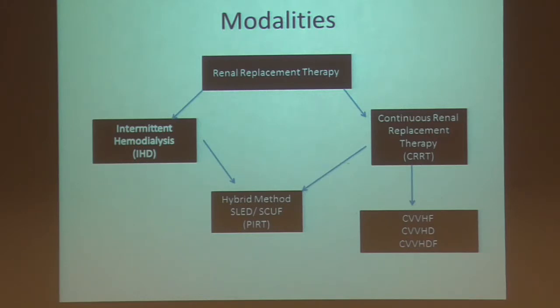The other question is, how do you decide what you want to do on the patient? Well, a lot of times it depends how much fluid you want to take off, or how sick they are, or how acidemic they are.